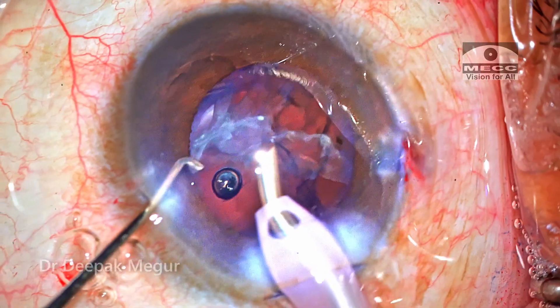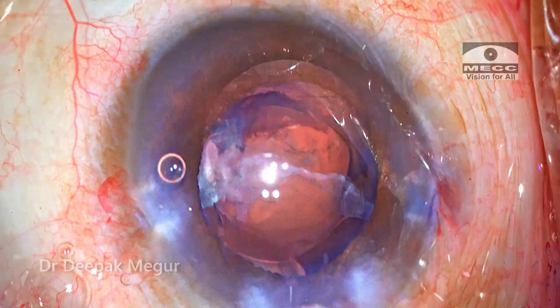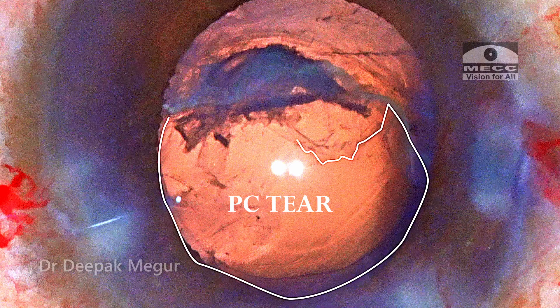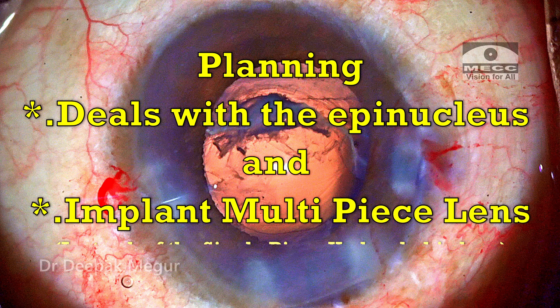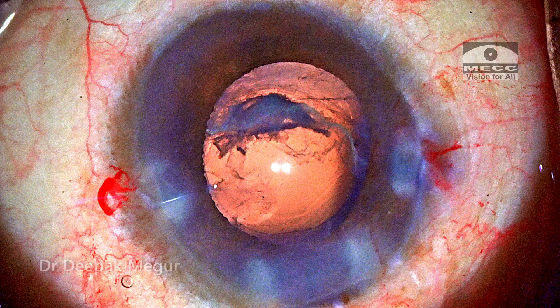Time to visualize the area of the posterior capsule defect. OVD is pushed in to push away the epinucleus a little bit. I'm getting a fair idea about the extent of the posterior capsule — and as I had imagined earlier, the proximal half of the posterior capsule is torn. The planning is very clear now: I need to deal with the epinucleus and then proceed with a multi-piece lens instead of the originally planned single-piece hydrophobic IOL. I'm still certain that the anterior hyaloid is intact because if vitreous prolapse had happened it would have clogged my phaco tip and emulsification would not have been possible.